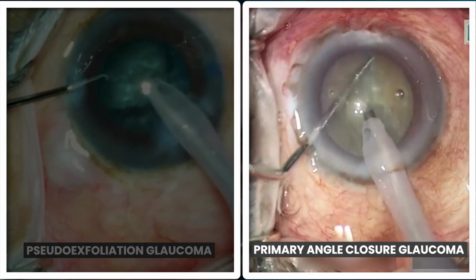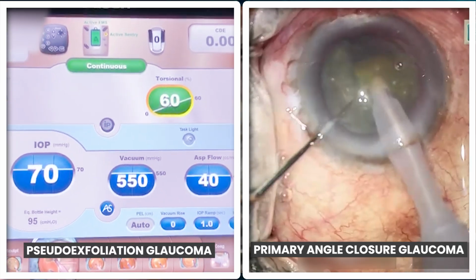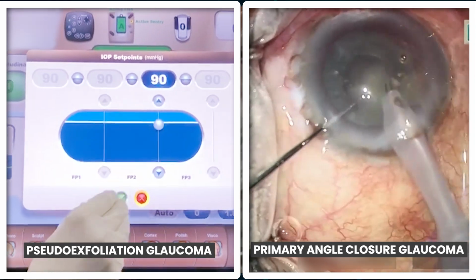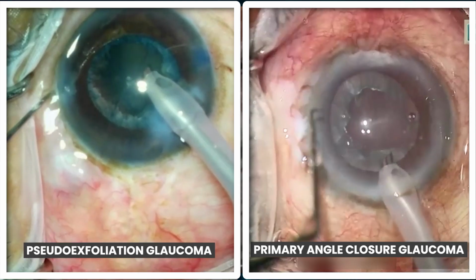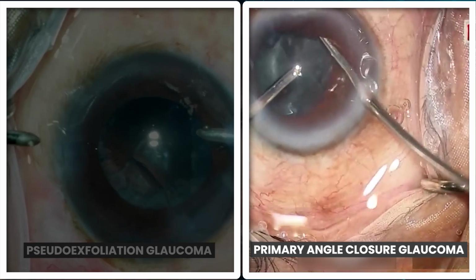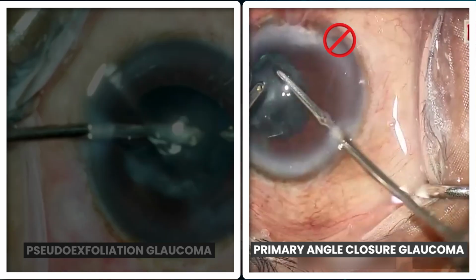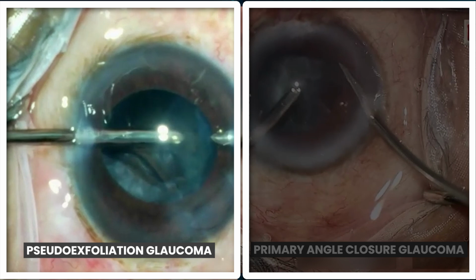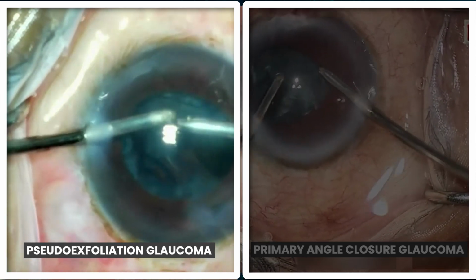A routine phacoemulsification should be performed. If the anterior chamber is showing a tendency to collapse, the infusion bottle height can be increased or the vacuum setting can be lowered accordingly. Iris manipulation should be avoided if possible, as it increases post-op inflammation and is associated with long-term bleb failure. A methodical and thorough aspiration of all cortical material is essential.